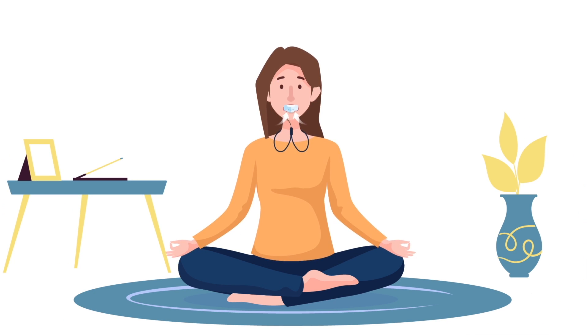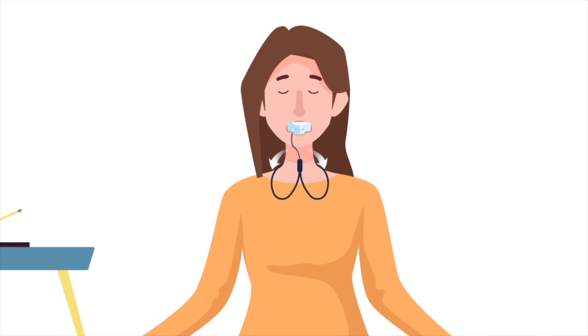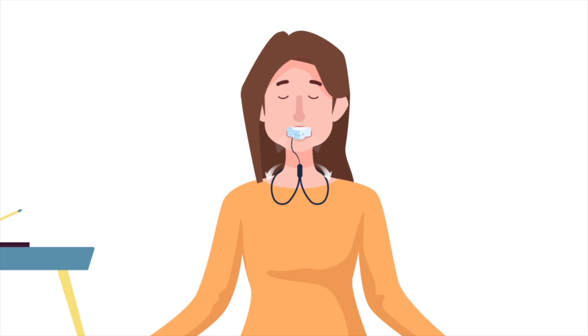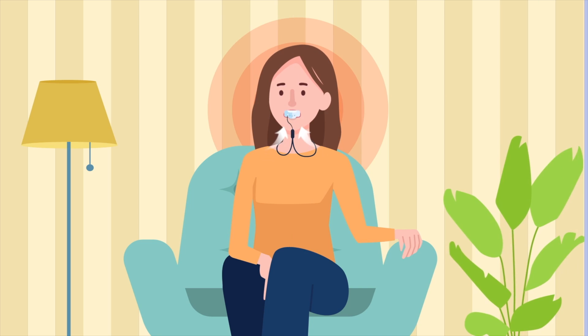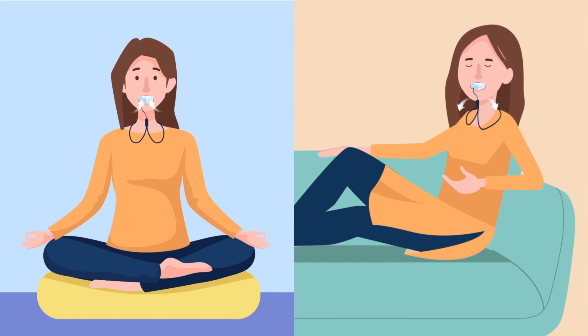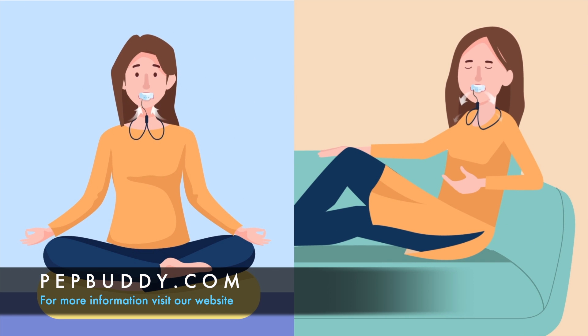For that you will use it in the same way — putting the device in your mouth, breathing in through the nose, out through the device. Maybe sit down, relax, try to calm down and focus on your breathing, and PepBuddy will help you do so much more efficiently. Try breathing like this for two to three minutes, two to three times a day, or whenever you're feeling a bit more anxious and stressed.